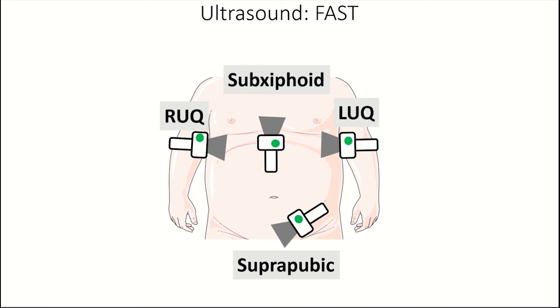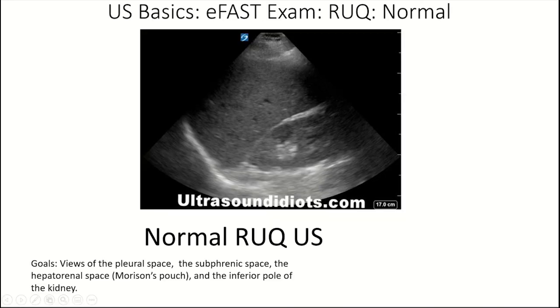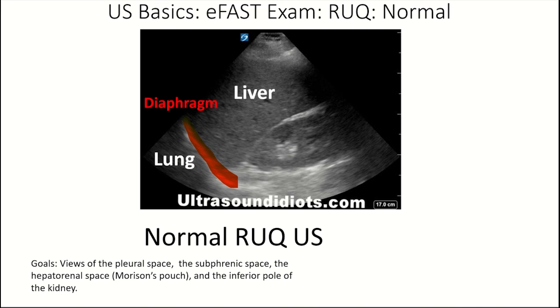Now we'll go through each area and look at prototypical images to identify hemorrhage. Starting with the right upper quadrant — here is a normal RUQ ultrasound. We note the white stripe that is the diaphragm, called the diaphragmatic stripe. It delineates both the liver and the lung. We see the lung above and then the liver. This area is called the mirror artifact of the lung — the echogenicity of the lung should mirror that of the liver, and if not, you think of a hemothorax.